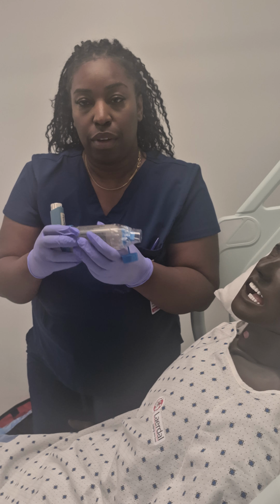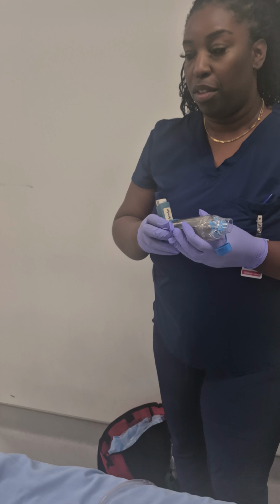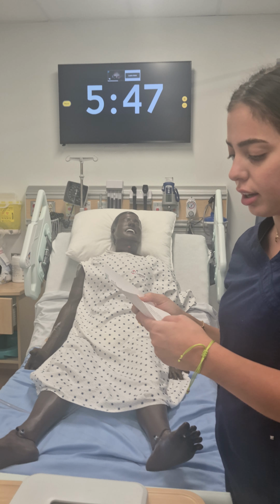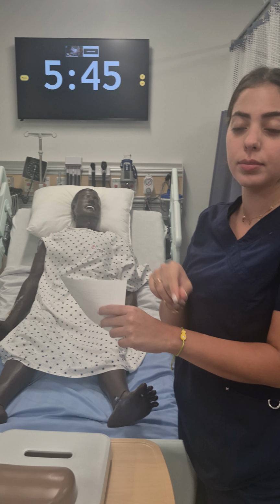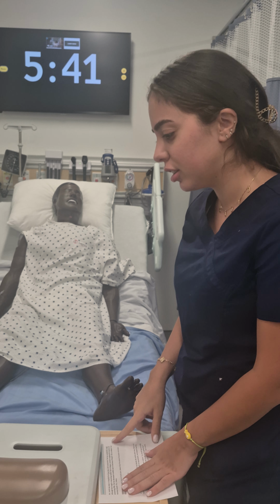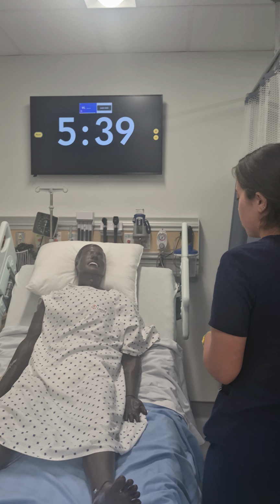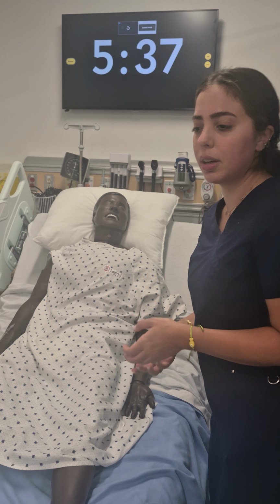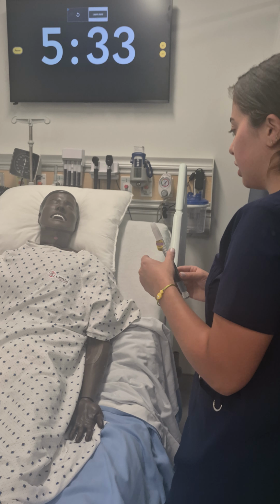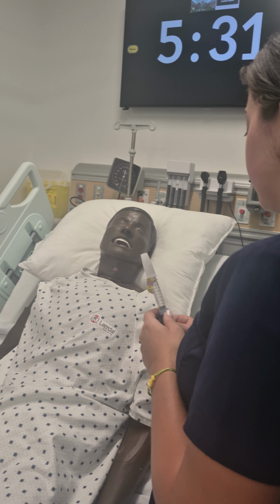and then remove the chamber after the puffs have been administered. Okay, so the patient is going to be receiving his insulin injection. So I'm just going to be explaining to the patient. So Mr. Smith, I'm just going to be giving you your 10 units of insulin that you get 3 times a day. Is there anywhere preferably that you'd like to inject it?